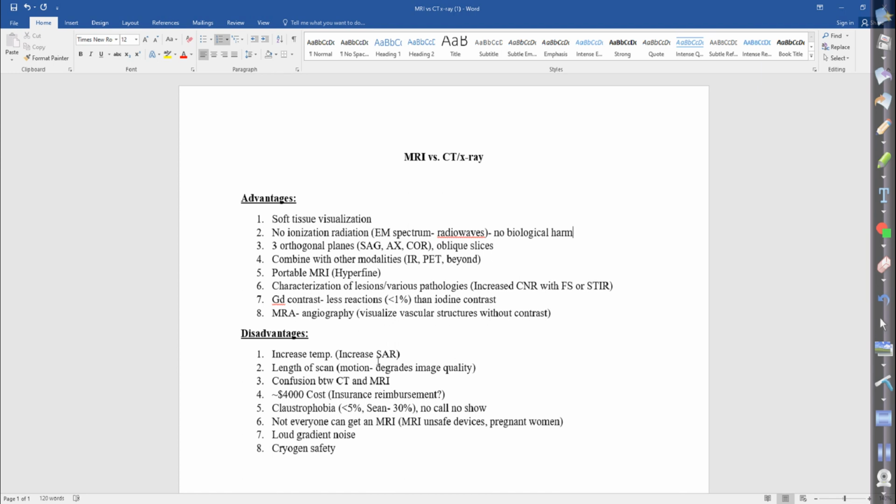Ionizing radiation has a higher frequency and a shorter wavelength. Remember that relationship? But radio waves have a lower frequency, in the range of megahertz, and a longer wavelength. That's really what makes them less dangerous, in terms of not being able to knock out electrons and cause ionizations, which can potentially alter your DNA, right? Those are the things that we've learned in X-ray, but let's now think about MRI and how it compares.